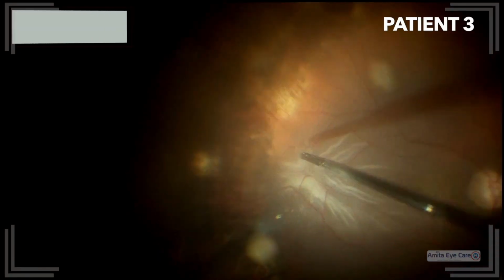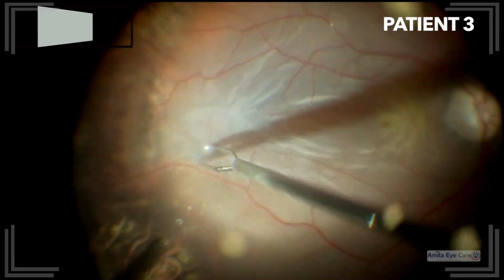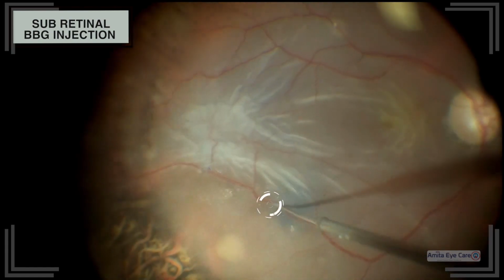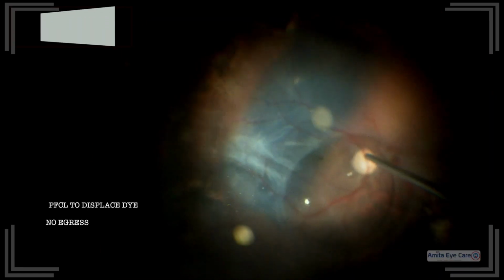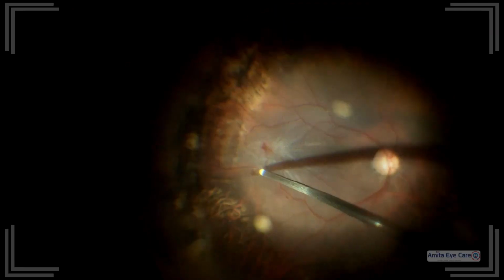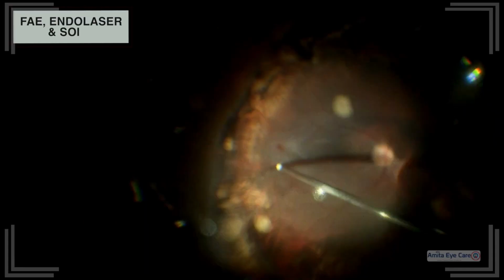In another case of recurrent retinal detachment, after peeling the PVR membrane we injected subretinal BBG to search for an occult break and found none. We drained the subretinal fluid after making a draining retinotomy.